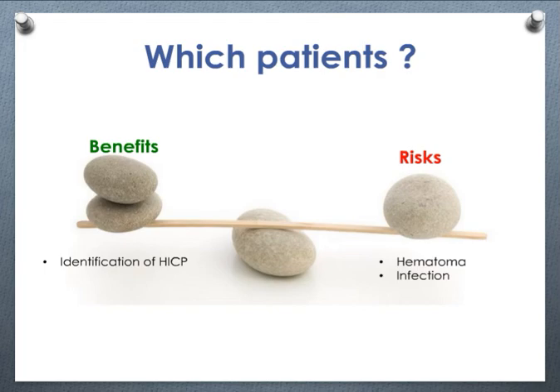If the risk of having very high ICP is 50%, I think you can consider the risk of having this kind of complication in the single patient, because there is a very high risk of ICP, and the benefit for the patient will be the important part of this trade-off.